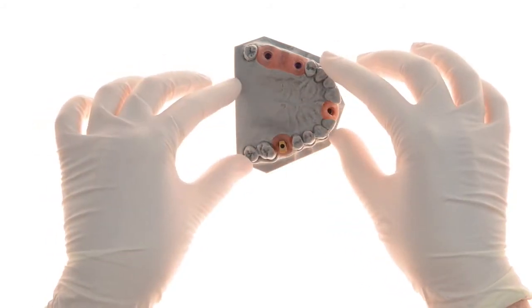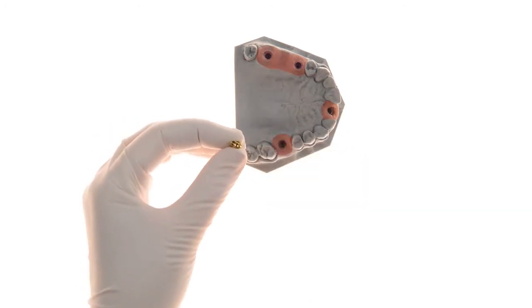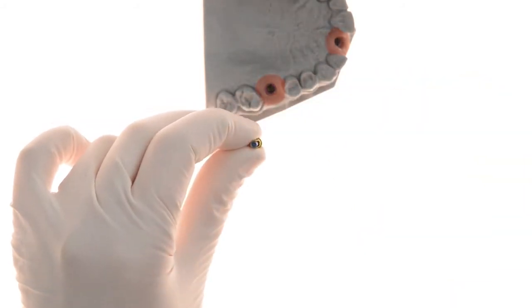With the CAD-CAM library implemented, EasyBase scanning is done either using stone models and wax-ups within the MLAB, or intra-orally scanning in the clinic and then sending digital files.